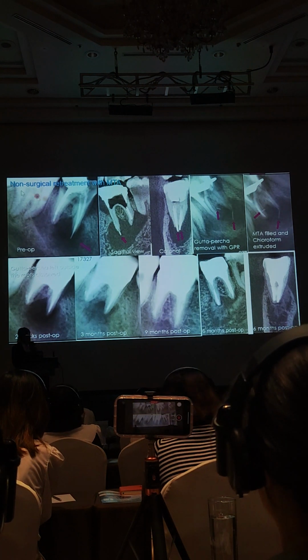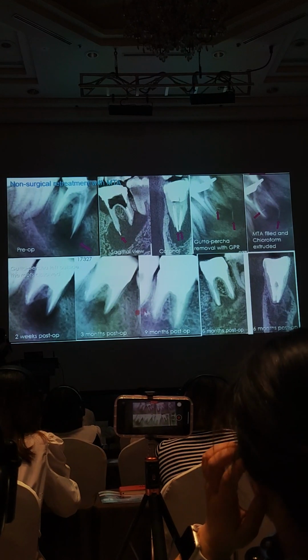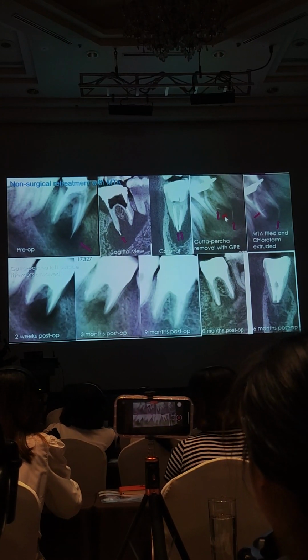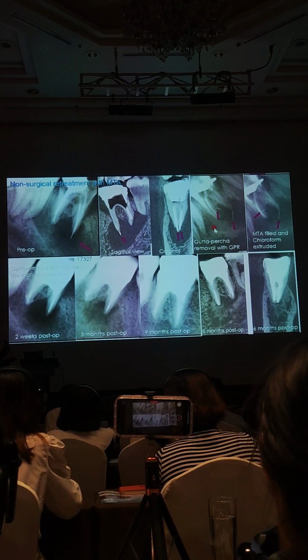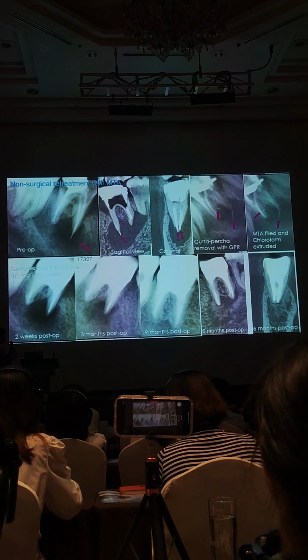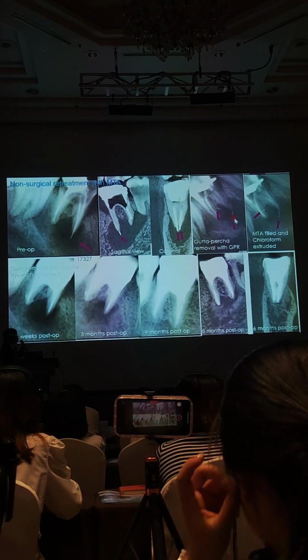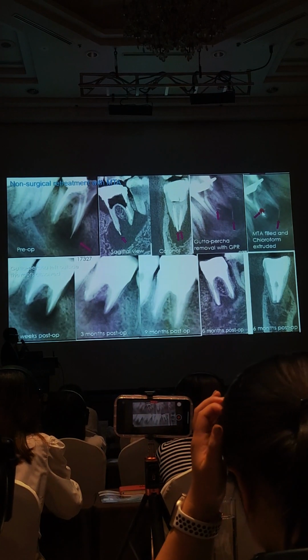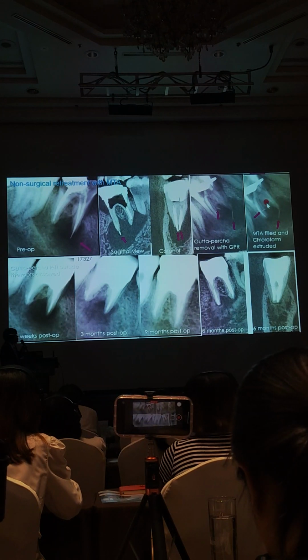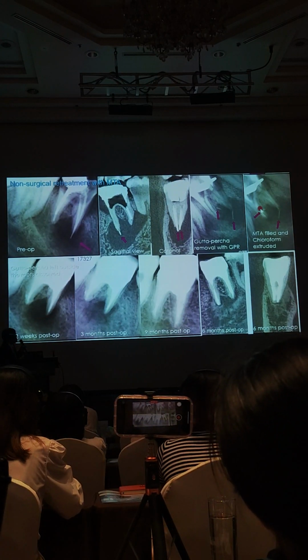Another case, you see a big lesion, huge lesion, gutta-percha fillings already extruded like this. However, I separated the gutta-percha again. So if you see the extruded gutta-percha, you have to be careful. Try to remove the gutta-percha in one piece. But sometimes you will end up separating the gutta-percha from the root canal. Then, look, the gutta-percha is not to the apical extent of the root canal. It's beyond it. So, especially this one, I cannot reach this gutta-percha filling.